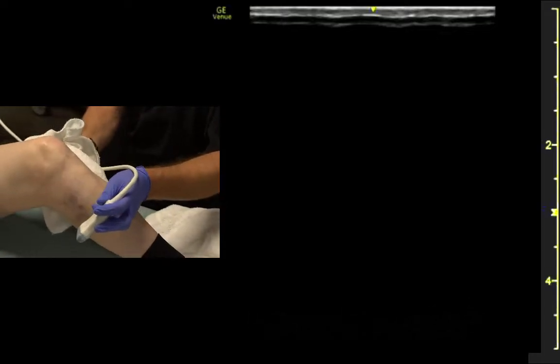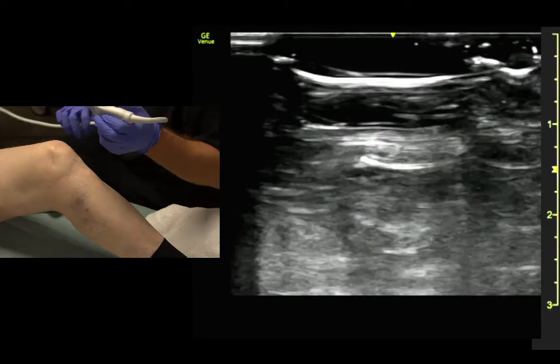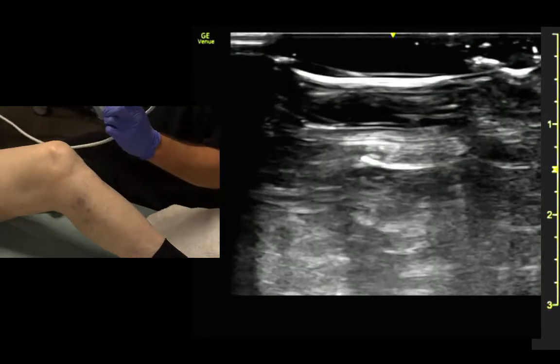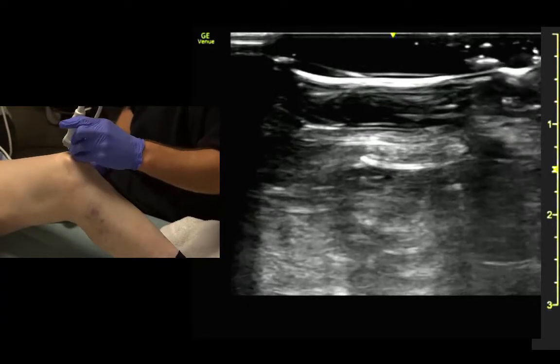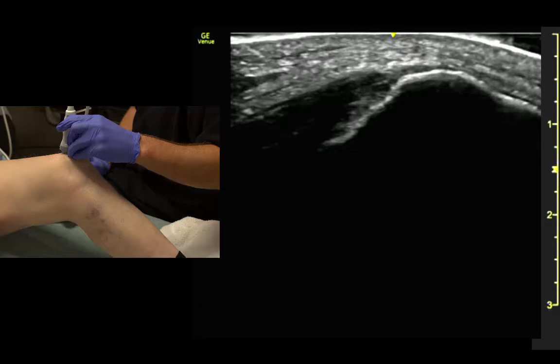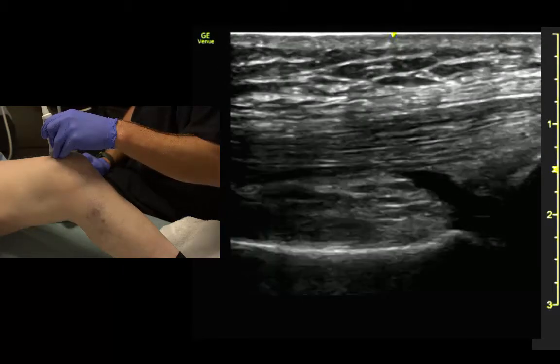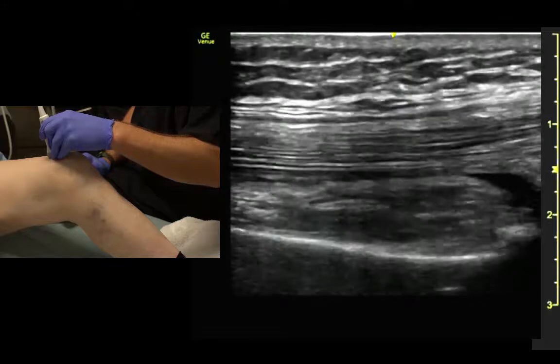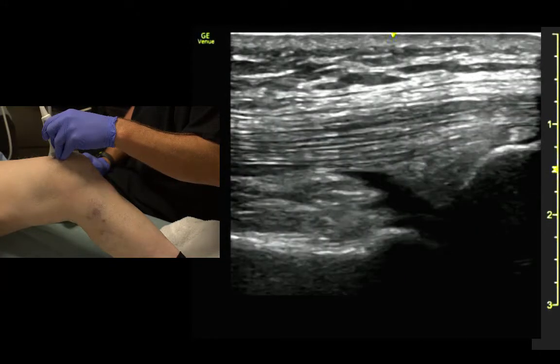Now I'm going to have you bend your knee just about 30 degrees. We're going to do some of the structures of the knee. First one is the easiest — we're going to look for the quad tendon. We line up the indicator towards the patient's head, get right on the patella in the midline, and start to slide towards the patient's head with a little side-to-side adjustment, and we can see the quad tendon coming off of the patella.